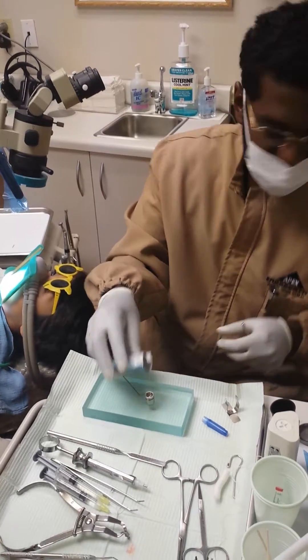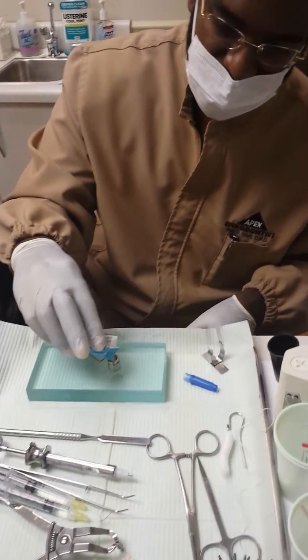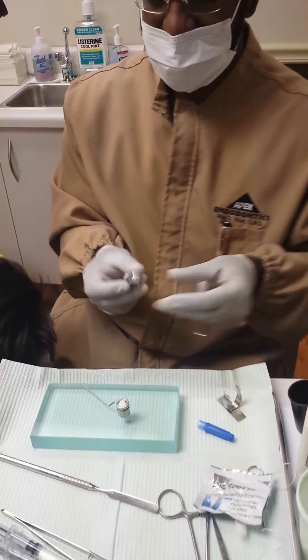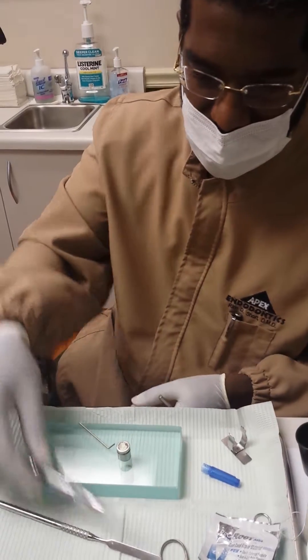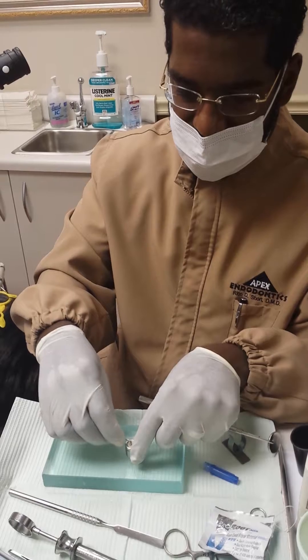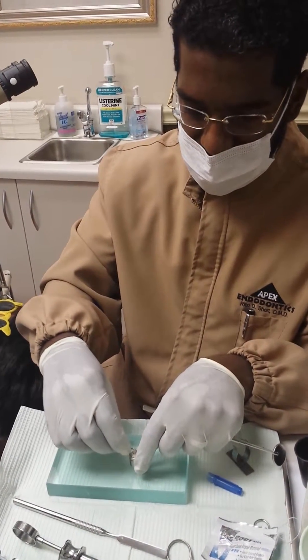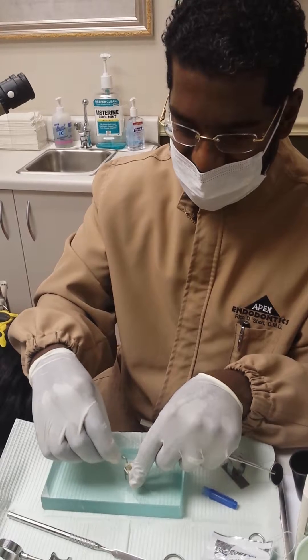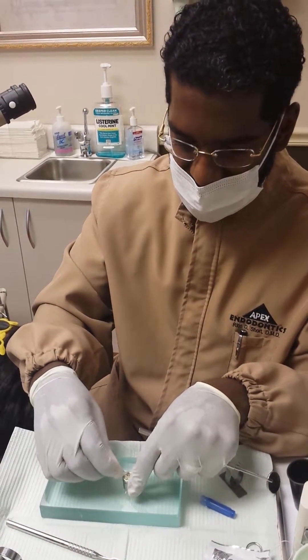I'm like, man, you're hiccuping out the chair. Now we're mixing up our MTA in a little — I call it the MTA well. This makes it nice so that you don't have to use so much MTA.